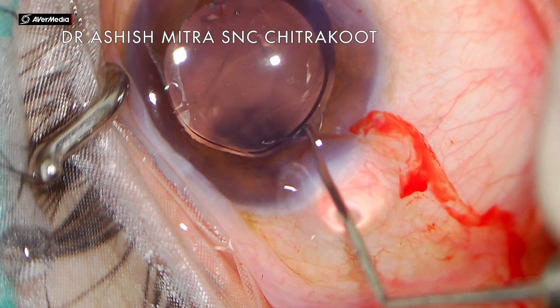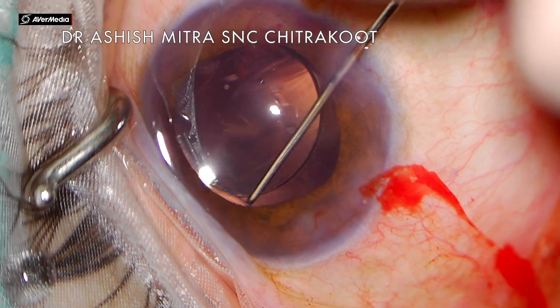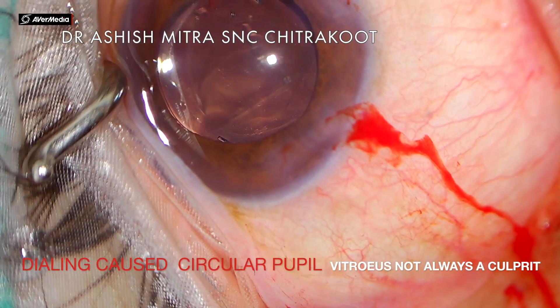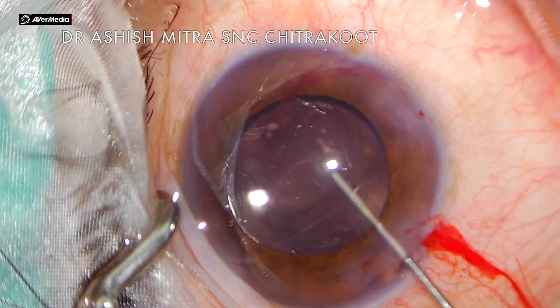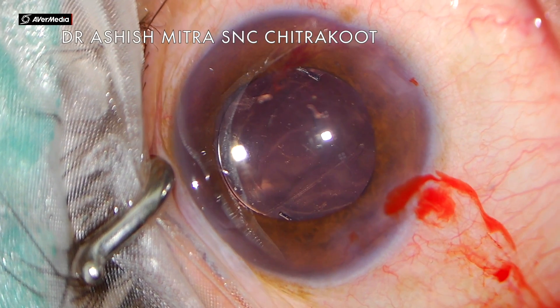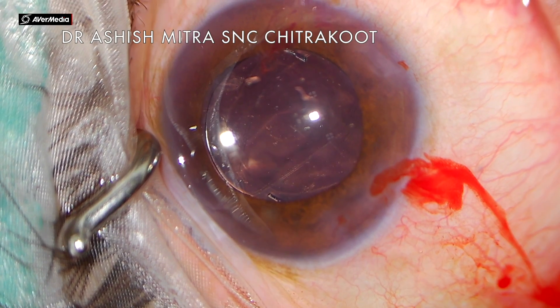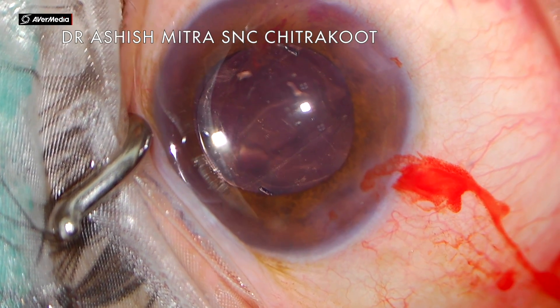Now I will be dialing and placing this haptic properly. As I dial this, the pupil will become circular — and that again proves there was no vitreous. Now you can see the pupil is circular. Just rotating this IOL caused the pupil to become circular. You have to analyze whether it is vitreous or whether it is haptic or IOL positioning that was giving the iris that eccentric configuration.